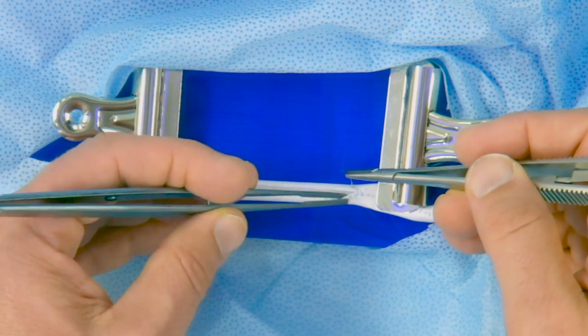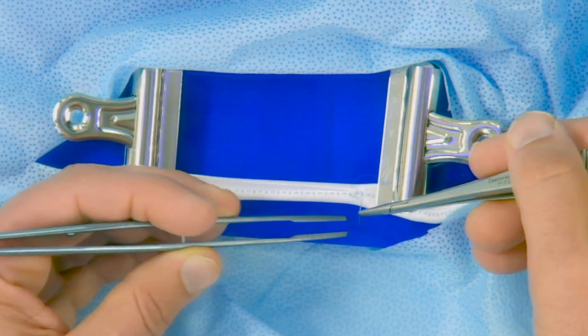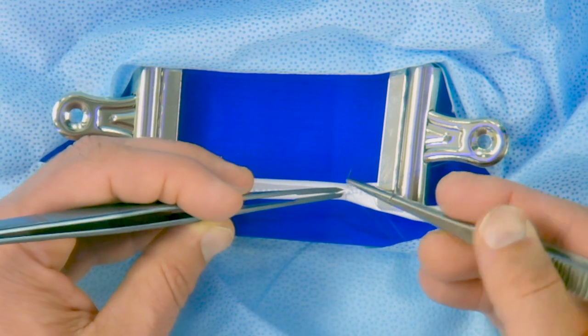The use of an assistant can be very helpful, and when using an assistant, you want them to pull the suture in the direction of the suture line, meaning the same direction that you're pulling the suture through the blood vessel.